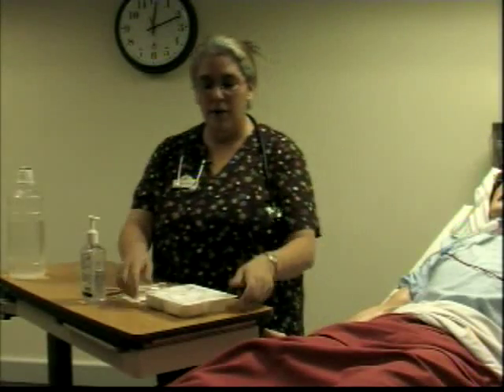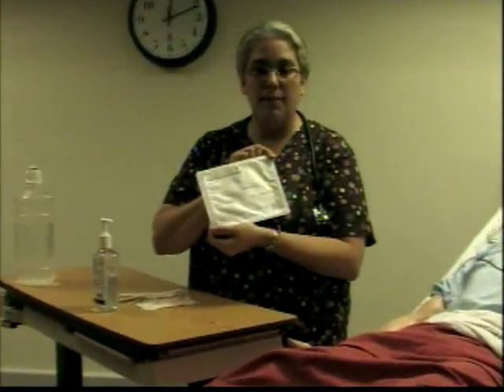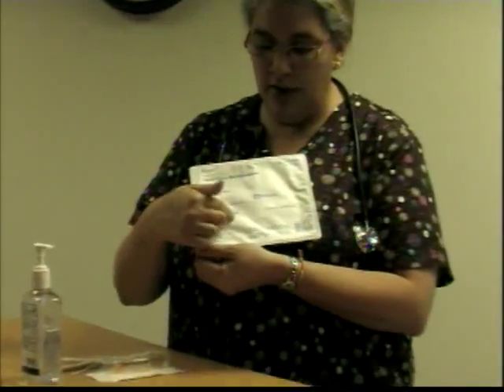So what I'm going to have here is just your trach care standard kit. We'll still have a couple of things in this kit that we're not going to use, and I'm going to mention that when I open the packet. The institutions are now working on creating a more user-friendly packet where you only have what you need rather than things that you don't need.